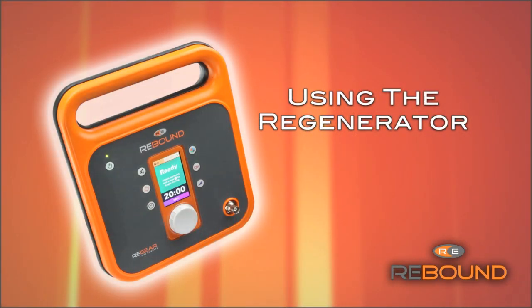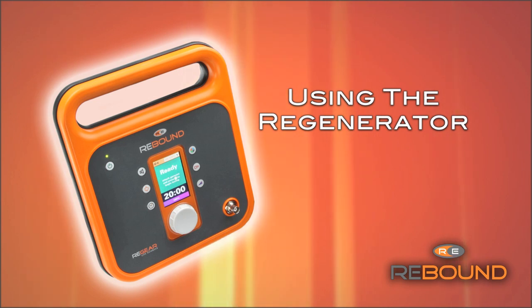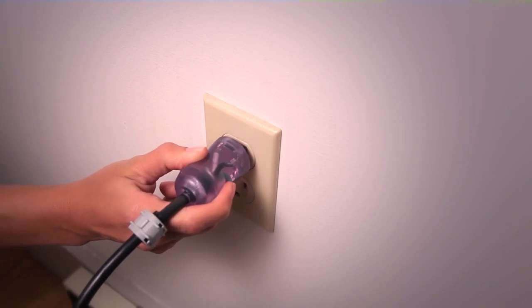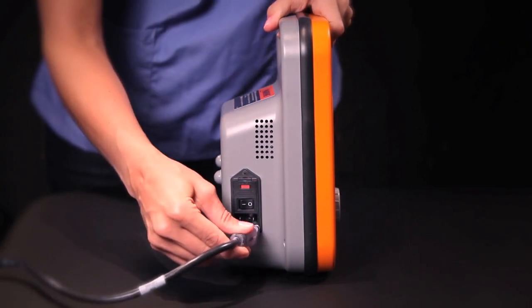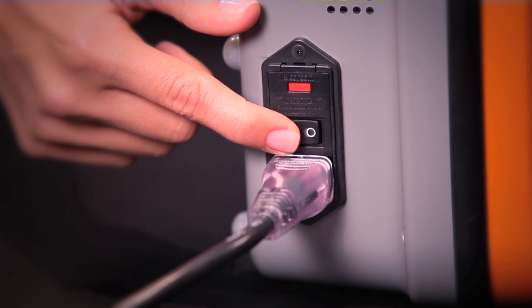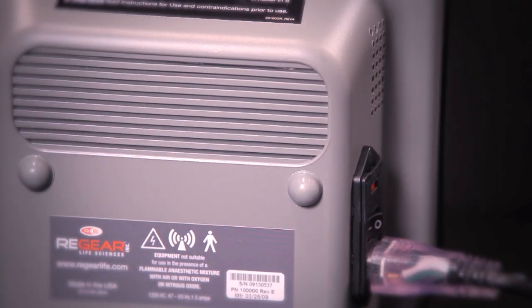The Regenerator is the control unit. It uses only 35 watts of power and operates at 13.56 megahertz. To get started, plug one end of the power cord into the wall and the other end into the Regenerator. Then switch the main power toggle on the side of the Regenerator to the on position. Once powered on, you'll be able to hear the fan.